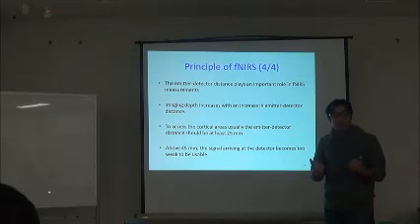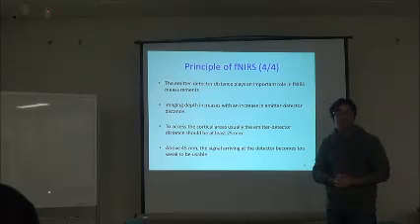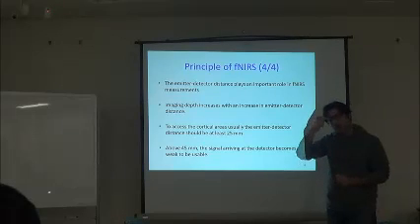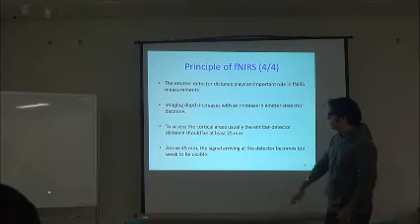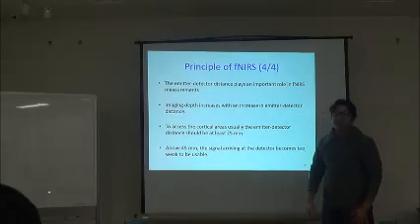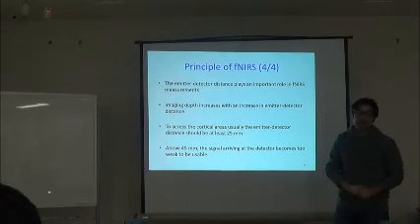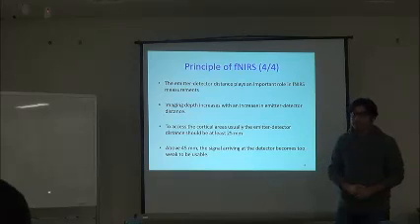If the source to detector distance is less than 25 millimeters, it might not go deep enough to measure the changes in the cortical areas. It might just come back from the upper part of the brain. So usually you have to maintain a source to detector distance of more than 25 millimeters, and as I told you before, we usually take it as 30 millimeters or 3 centimeters.